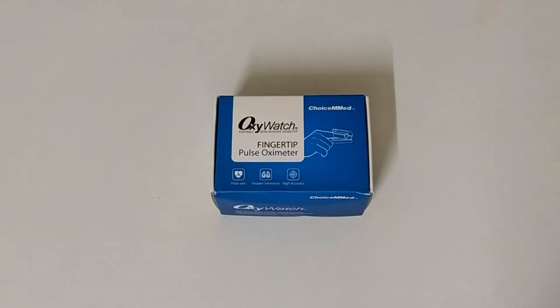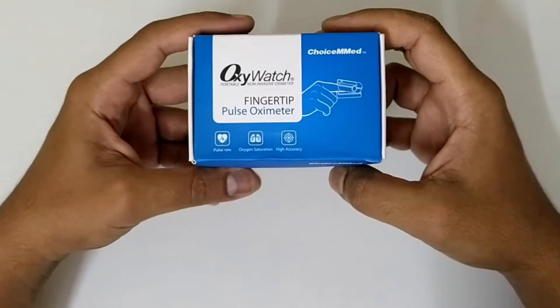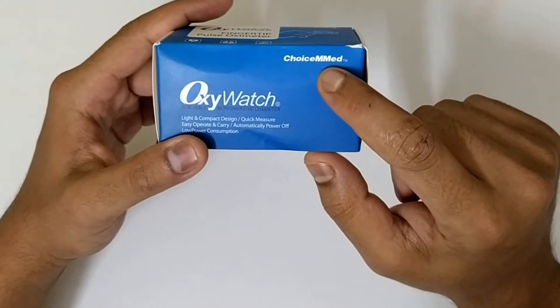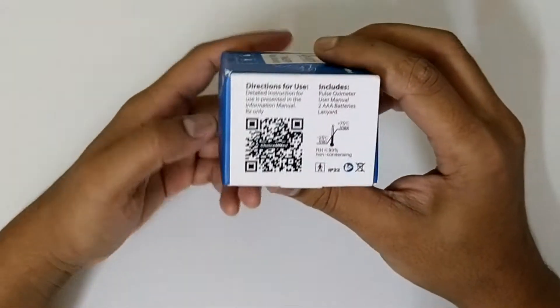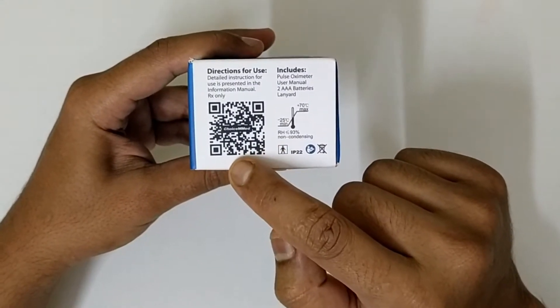Hello guys and welcome back to another video. Today we are looking at this device called an oxymeter — a pulse oxymeter. The brand name is Oxy Watch and the company name is Choice Med. You have the directions for use here; you can just scan this QR code to get the simple instructions.